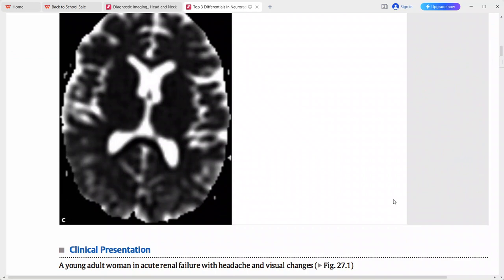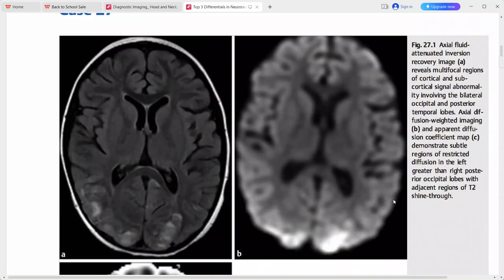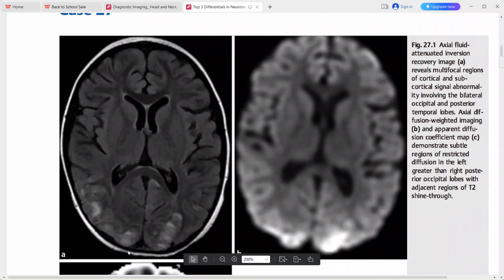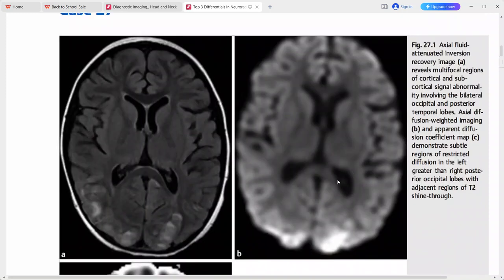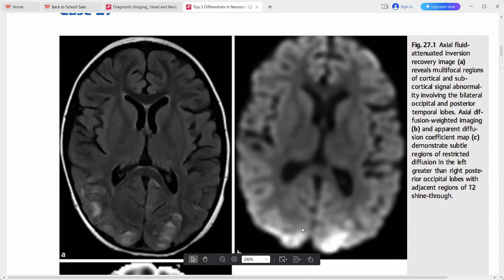This is the next case: a young adult woman in acute renal failure presenting with headache and visual changes. The FLAIR sequence shows multifocal regions of cortical and subcortical signal abnormality involving the bilateral occipital and posterior temporal lobes. On DWI and ADC mapping there are subtle regions of restricted diffusion.